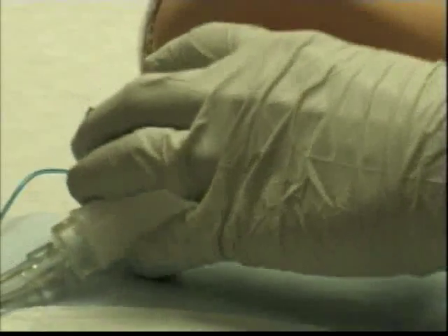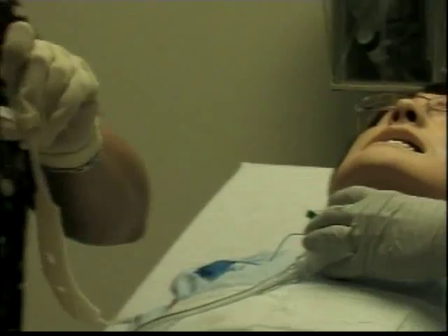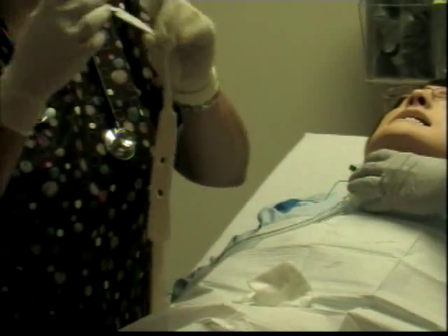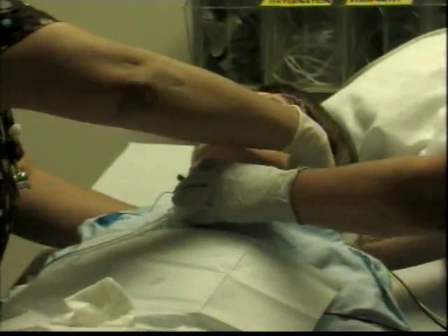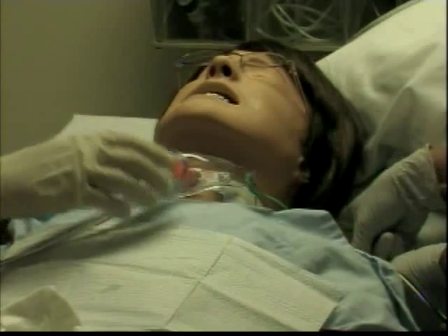For this, you want to make sure that you have it in such a way that it'll be easier for you to do. You see that this has Velcro in it. So when you position it behind the patient, you want to make sure that you have it in the correct way. So I'll ask my assistant to put it right underneath the patient. Okay. So we have both sides already in here.